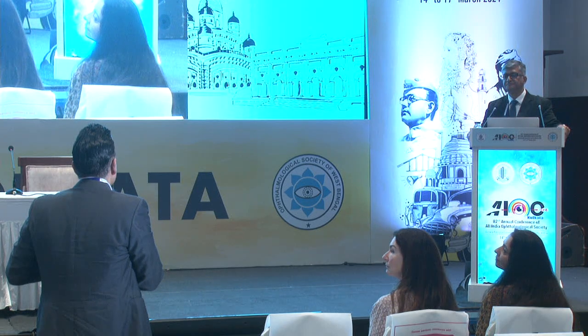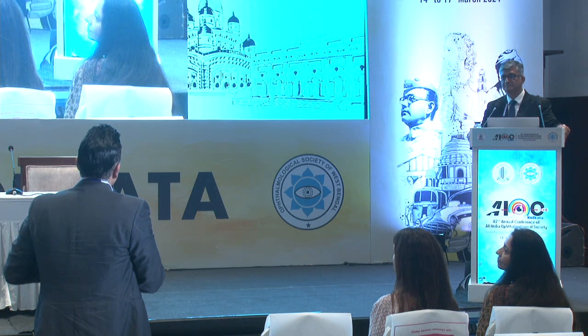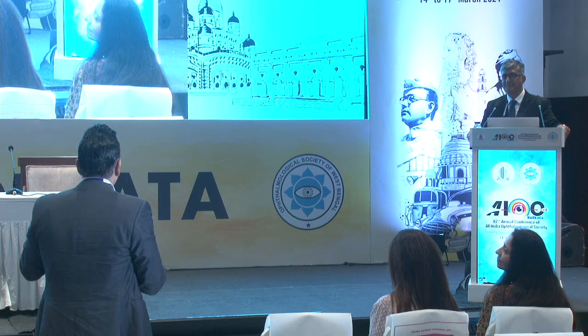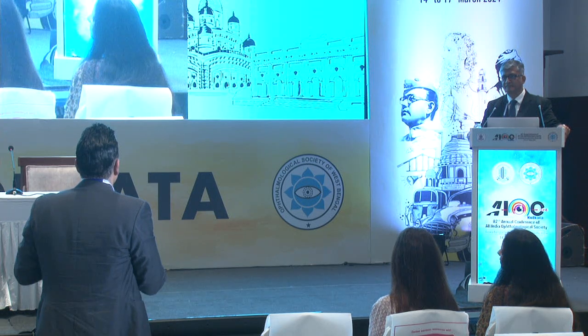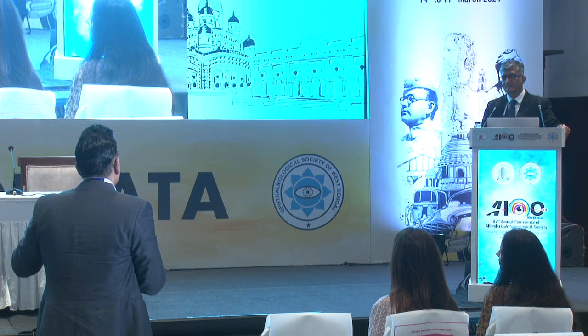And the other thing is that, especially in the higher levels, like grade 3 or 4 and above, your quality of vision is always impaired, because of course the coma level is still there from the keratoconus, which is not fixable by any procedure. On the lower grades, do you combine the treatment to try to treat the aberrations with any laser procedure after crosslinking? So what are your thoughts on that?